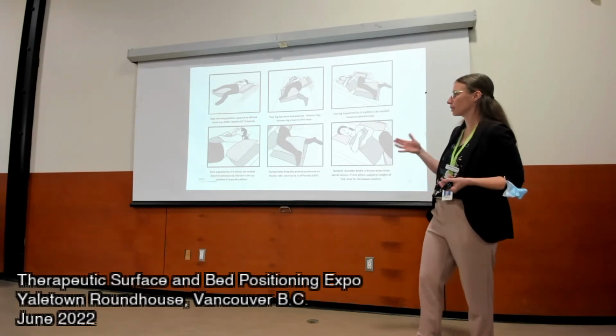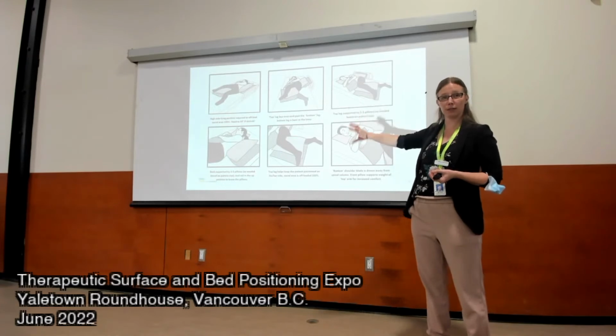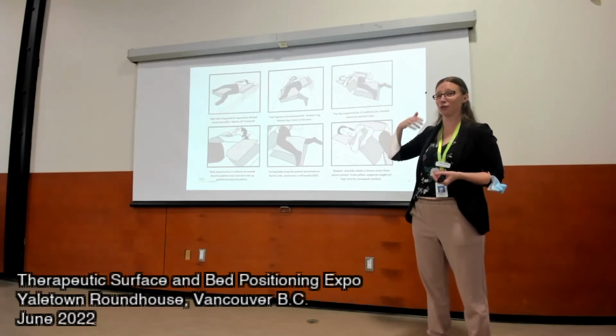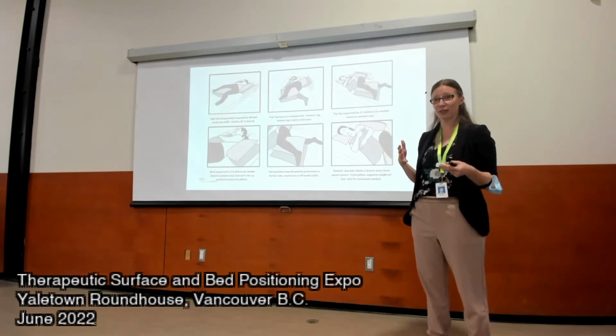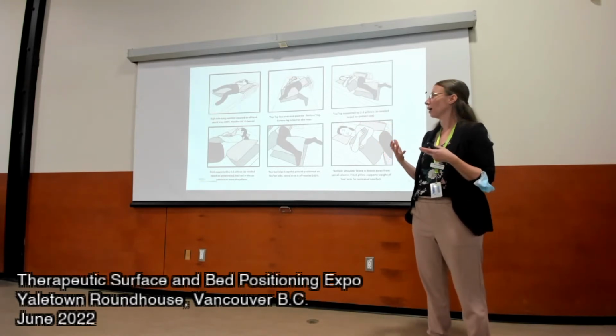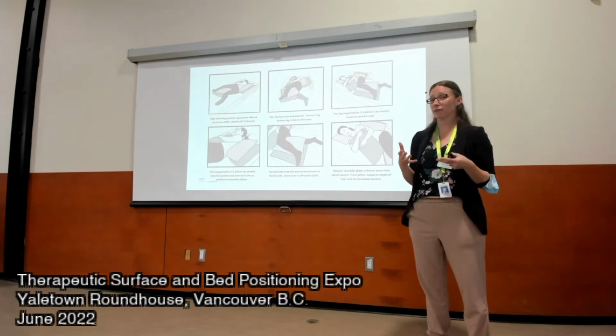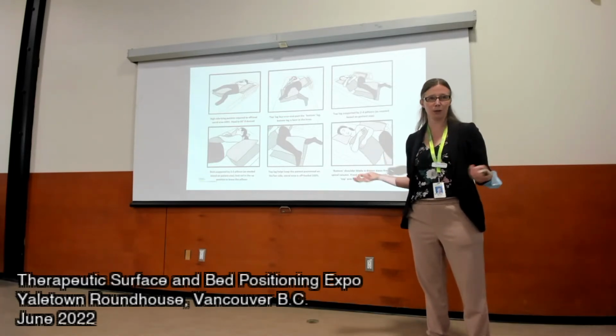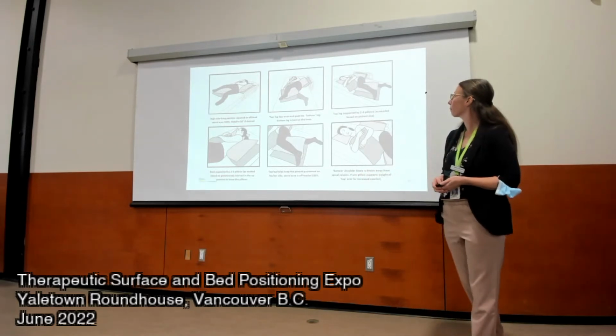So if you have somebody that you need to do all of this with, we would recommend actually getting different devices, some positioning devices to help support them. And the positioning devices will also improve comfort because they will provide better support.